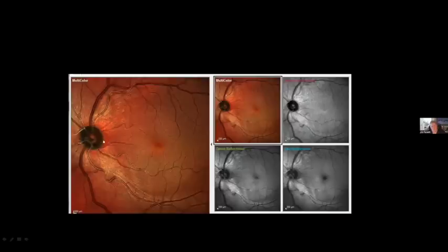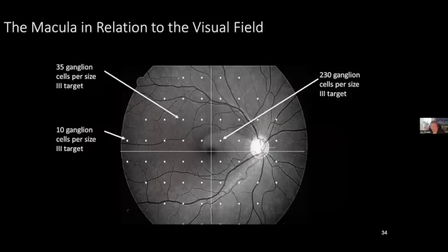Bottom line, when we're running a visual field, we're testing all of the plots, all of the areas within these particular images, and we'll be able to identify visual field defects that are, for example, here in this wedge defect, but not elsewhere. And that's kind of just a basic overview of what's happening from a glaucoma perspective.